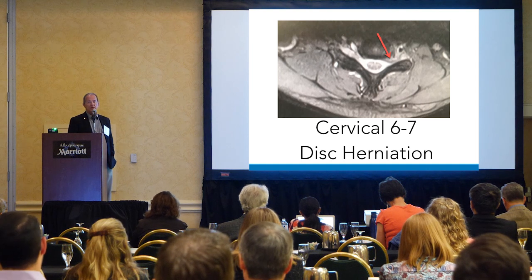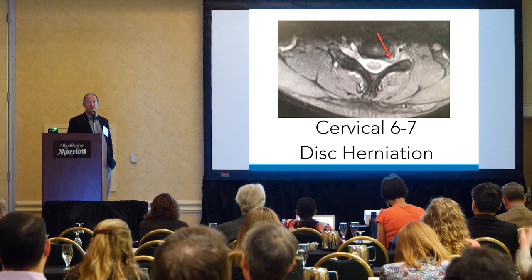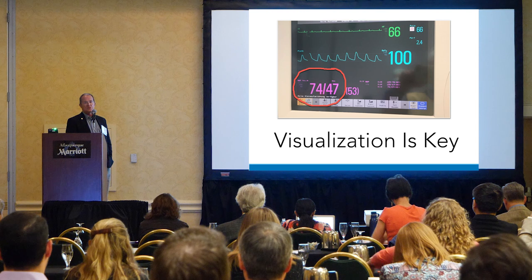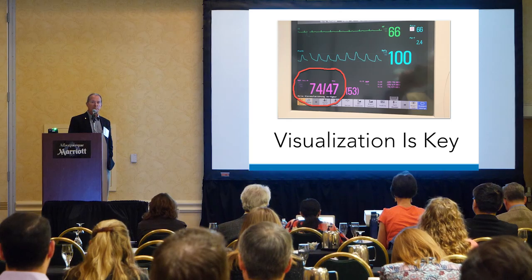So in this example, we're going to do a 6-7 on the left. This is a large disc herniation, 6-7 on the left. As I said before, if you're going to do this surgery, it's really like shoulder arthroscopy. You want to keep the bleeding to a minimum, and the best way to do that is to maintain a systolic blood pressure of 90 or less.